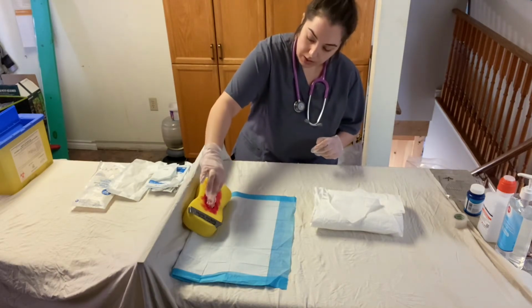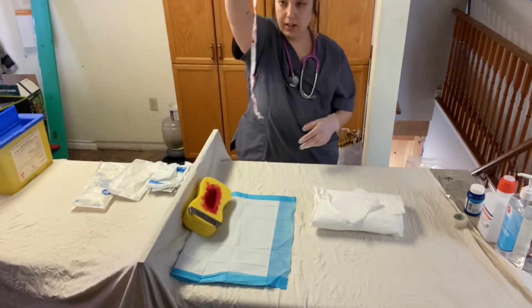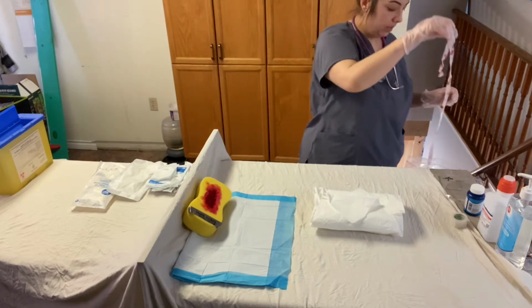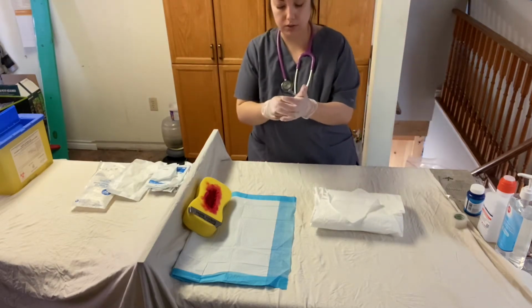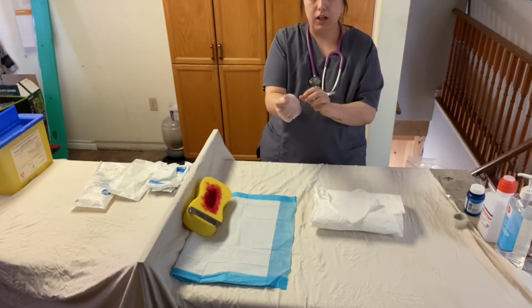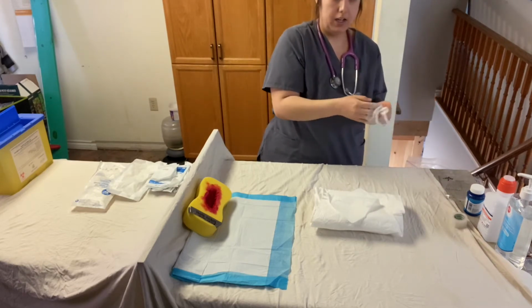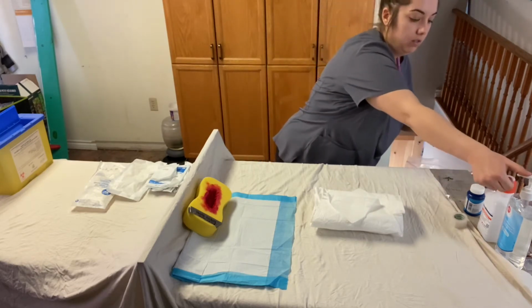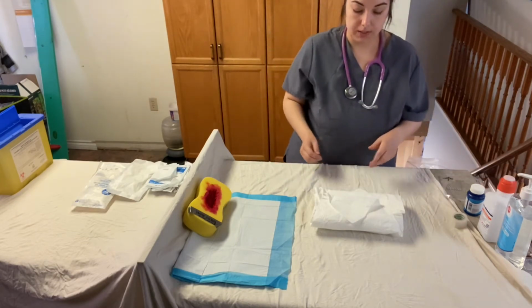Robert, this might be a little uncomfortable. I'm just going to take out the ribbon gauze that is packed in there. And again, assessing a little bit of dry blood, nothing to be concerned about. So I'm going to now remove my pair of clean gloves, and I'm going to perform my hand hygiene again. Perfect. Now I'm going to open my sterile dressing tray.